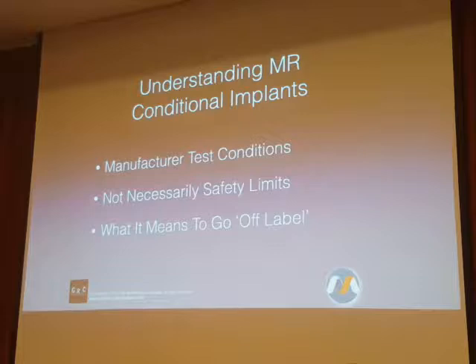I can set up the test so that I'm concerned about heating, and so I want to make sure that I test it in a way that it doesn't heat, so I don't jeopardize the opportunity to get my MR conditional label.